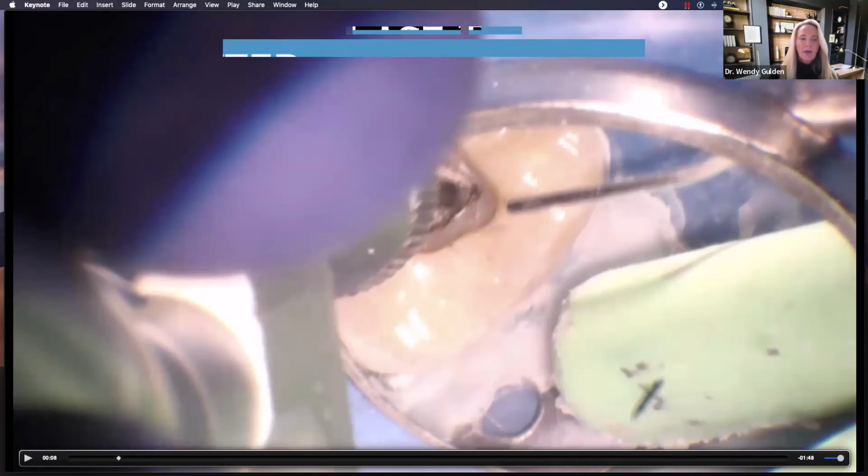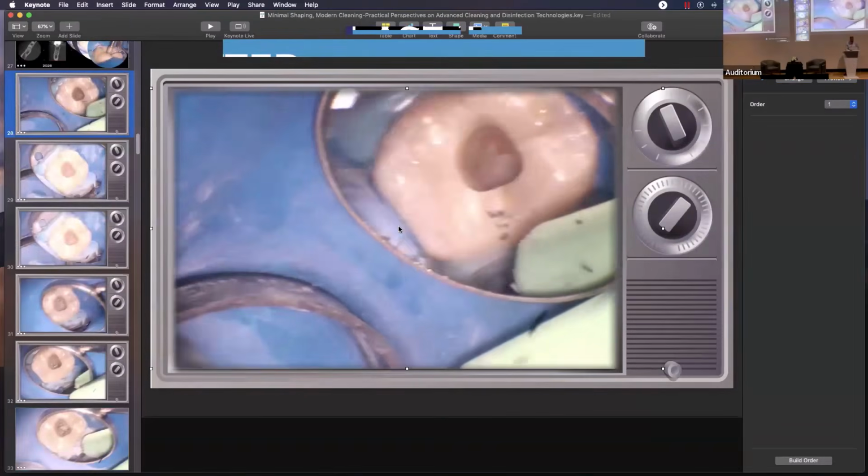Yes, that makes sense. Someone was saying you like to use dry to locate the calcified canals. Is that true? Oh, yeah. The typical routine will be: get through the restorative material, cut a big access through the restorative material, neck down, go down some until the little hairs stand on the back of my neck, wet.